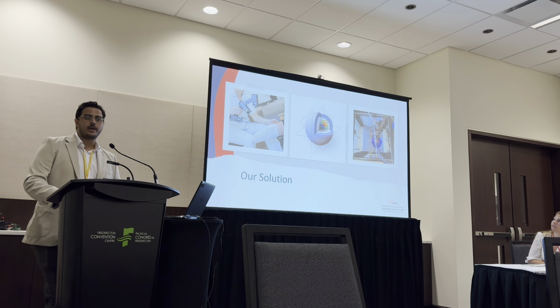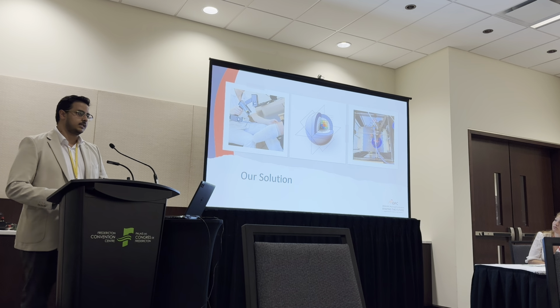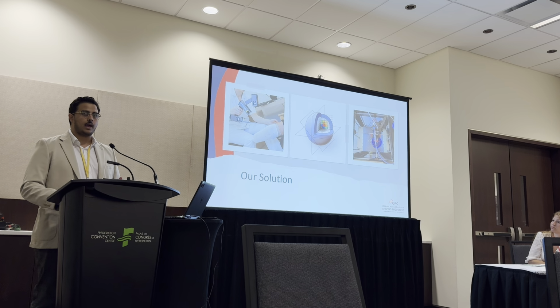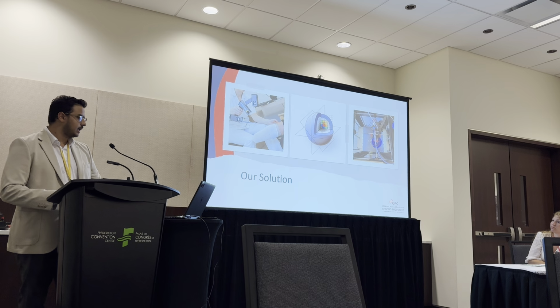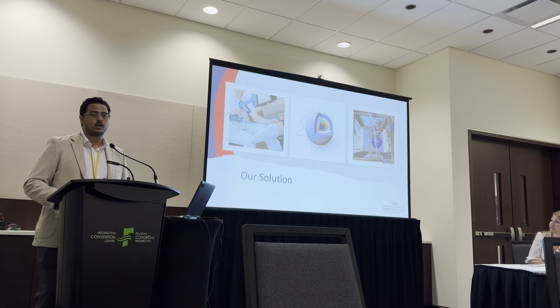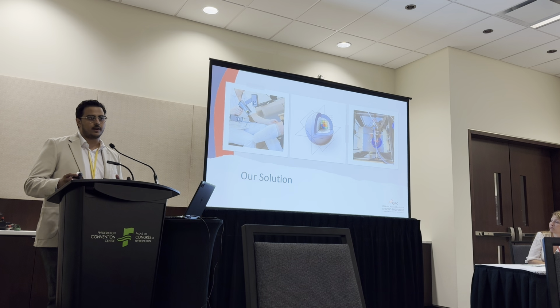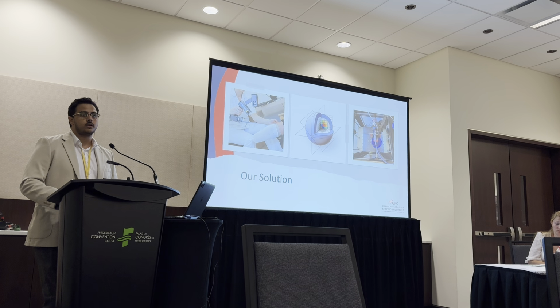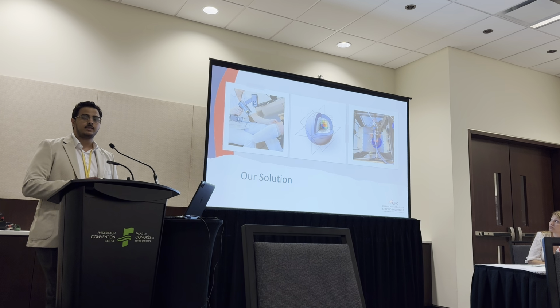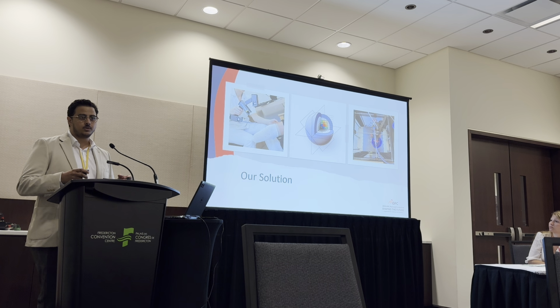So the solution that we came up with was, when the prosthetist decides that an amputee needs a refitting, they would ask the amputee to come into the hospital or to the clinic, have their residual limb scanned, and then we would combine this scan, or the rectified version of the scan, with the old rectified scan that was taken to create the initial socket. We would then combine the two scans, align the two models together, and create a model of the thickness in between these two models, which is what we're calling the insert.